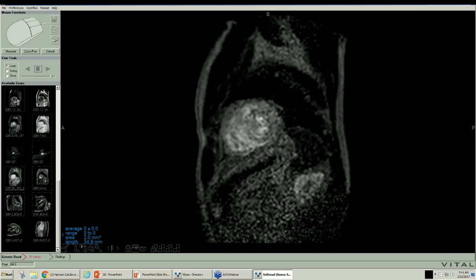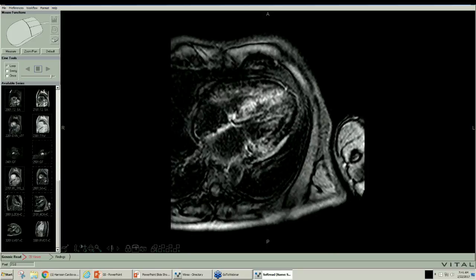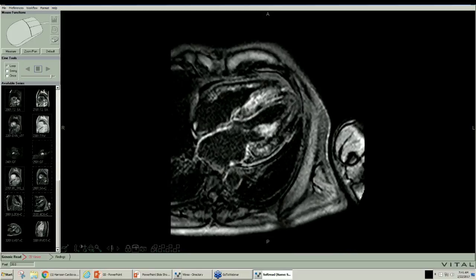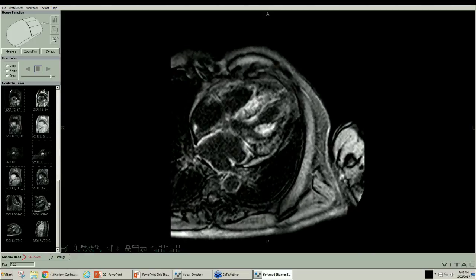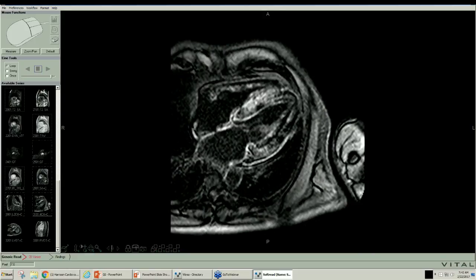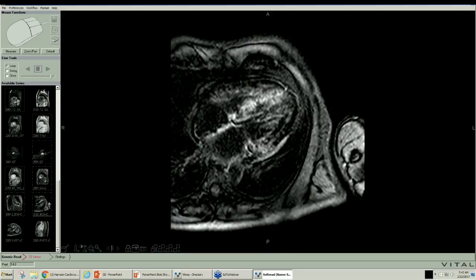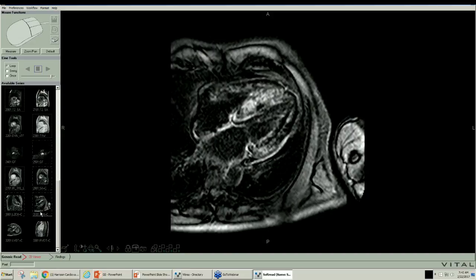We can't null it. And actually, you might be able to get some semblance of how much amyloid he has, so this should all be black. Now we're at the late gadolinium enhancement stage, and all this white stuff in here is amyloid disease. And what you don't see is amyloid disease too. Even the papillary muscle is amyloid. So the white stuff is late gadolinium enhancement throughout the left ventricle, epicardium, myocardium, sort of down to almost endocardium, papillary muscle. Some areas we don't see it. That doesn't mean it's not there. That means it's just not there in great bulk.